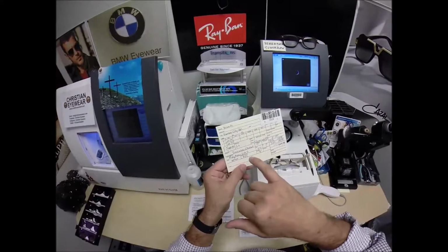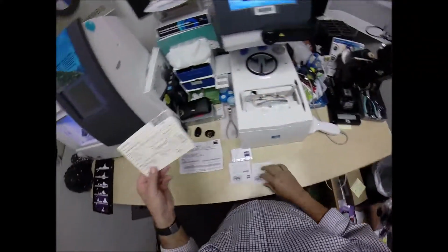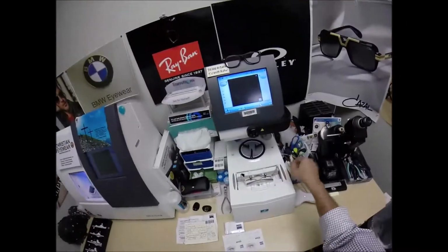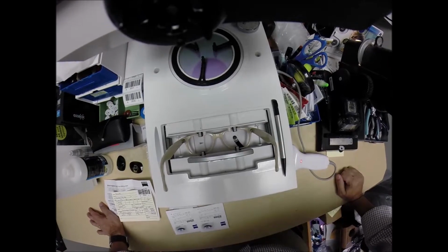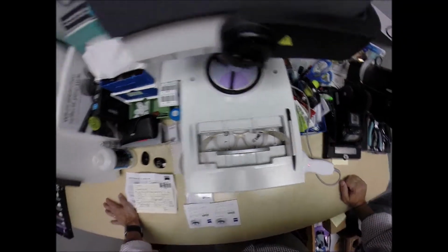I'm going to program this number into the database, so years from now, should you ever need new lenses, I can pull this up and have your pupillary distance and the optical center height. Should I need to take the lenses down at all, but I won't. But I have that stored for every frame that I cut. I'm going to hit the green start button. A little stylus is going to pop up, go around, trace the inside bevel of the right side of the frame before doing the same thing on the left.